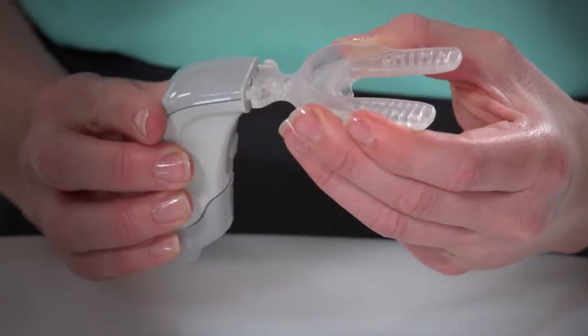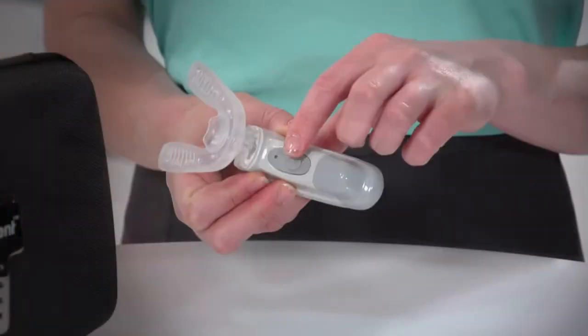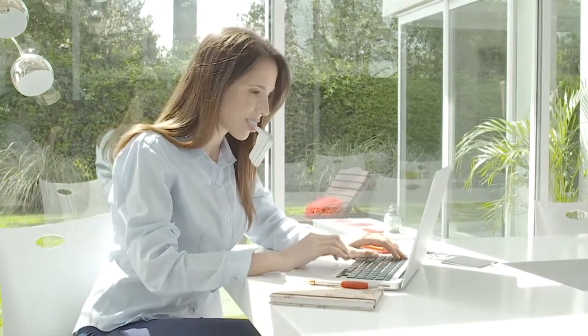Insert the mouthpiece fully into the activator, then press the power button. Once activated, gently bite down on the mouthpiece with just enough force to keep it in place. Avoid biting forcibly on the mouthpiece as that could cause excessive wear.